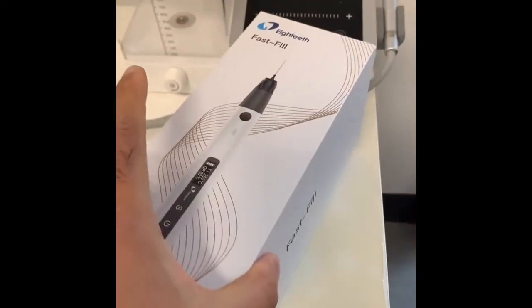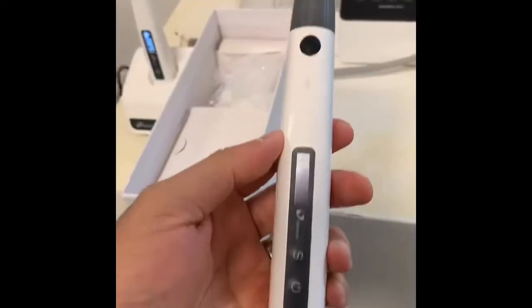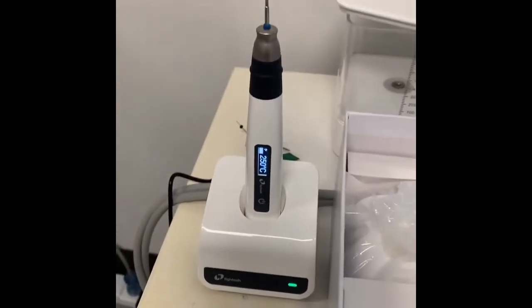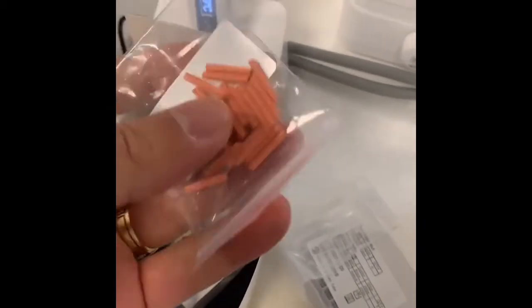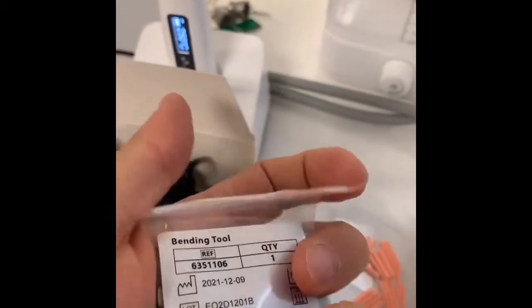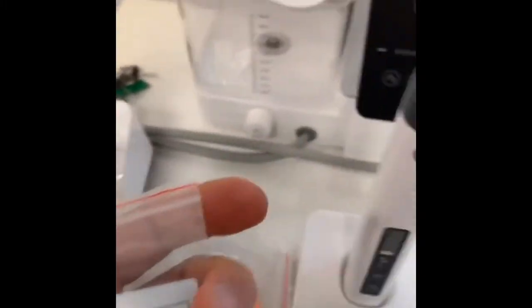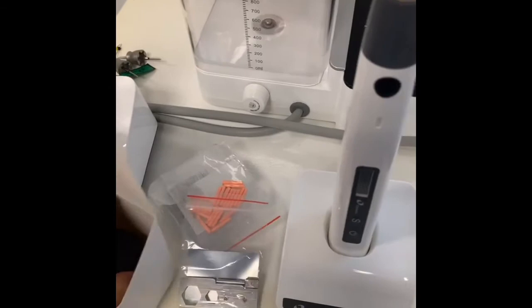Let's open the Fast Fill now. Just beautiful packaging again — I love it, it's so professional. Here's the handle of the Fast Fill, and the rest of the components are here. This is charging beautifully — you can see the green light. In this box, you have the cartridge and the gutta percha pellets. Everything you need right out of the box. That's the bending tool to bend the tip, and the charger. Let's put everything together.